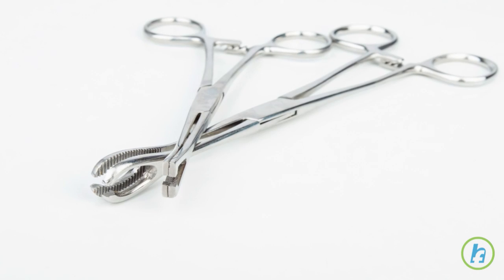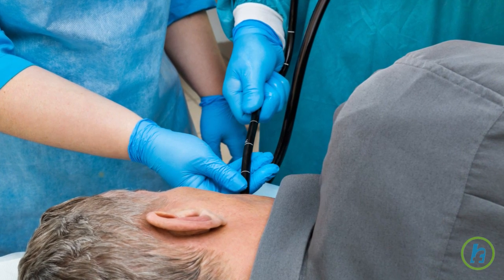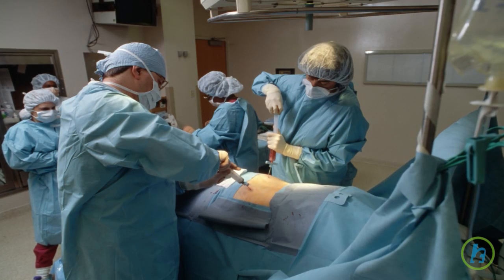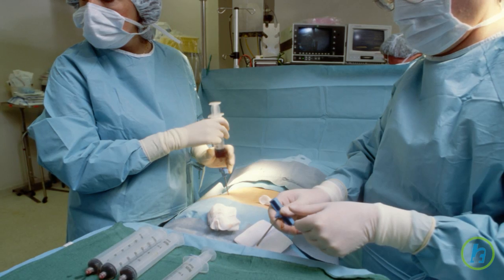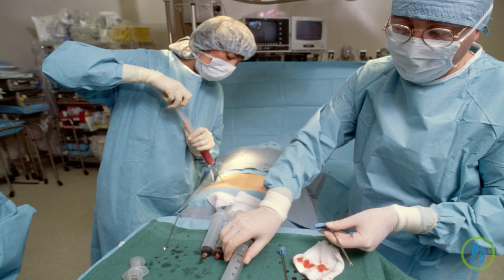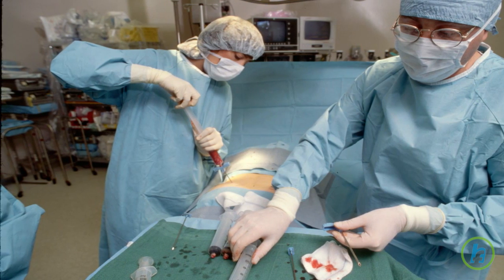Forceps and brushes that remove tissue samples can also be guided through the tube to obtain a specimen. Bone marrow biopsy uses a long needle to remove cells from the bone marrow. Following administration of a local anesthetic, a large core needle is inserted into the bone.